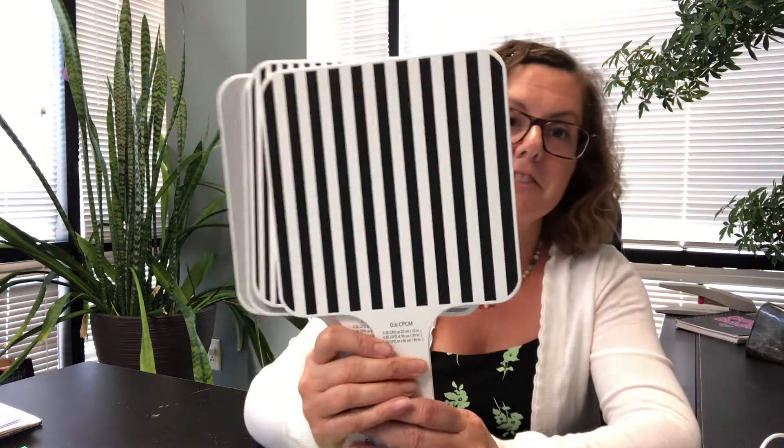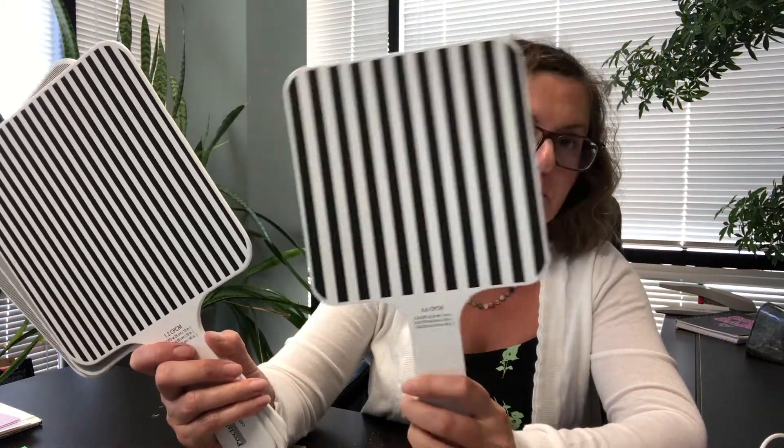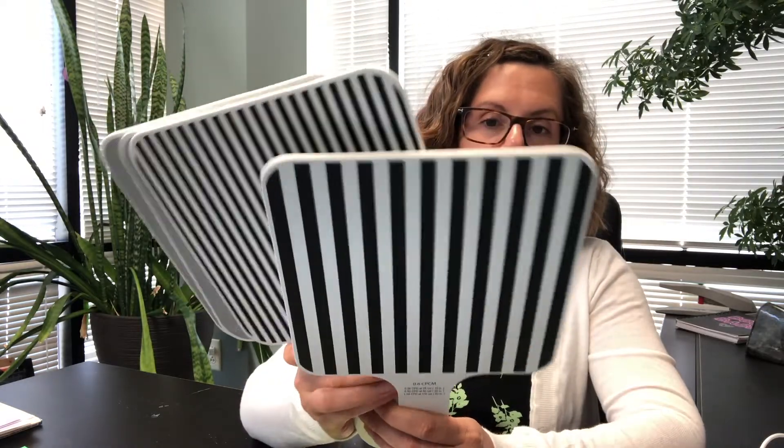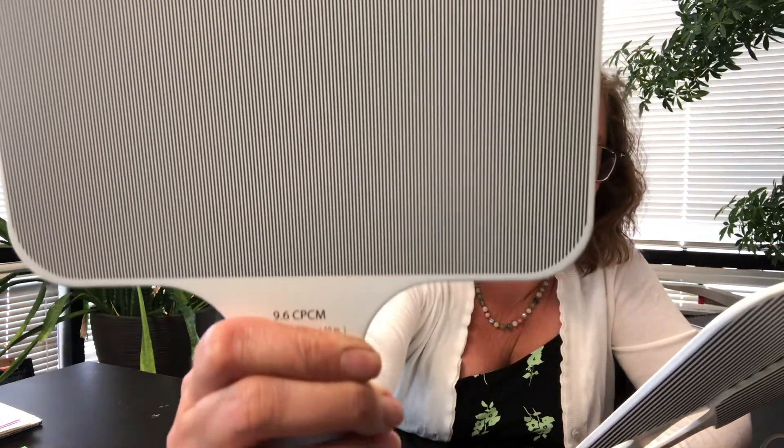I'm going to start by showing you some of the things we use for measuring the acuity of infants. We have these paddles where we can measure their ability to see stripes and pay attention to things. In infancy, you would block your face with some of these. You can see there are lines on here, and how much they pay attention to those lines can tell you what their level of visual acuity is.